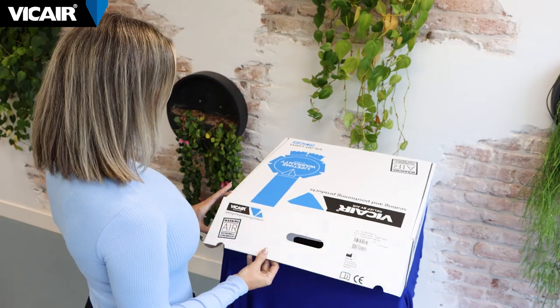In this video I will demonstrate the unboxing of the Vicair wheelchair cushion and the initial setup. Most Vicair cushions are delivered in a box that looks similar to this one.